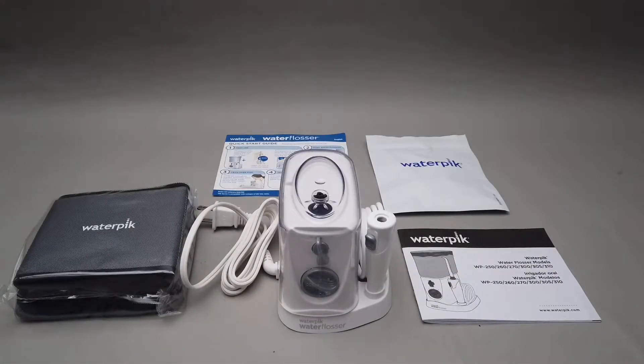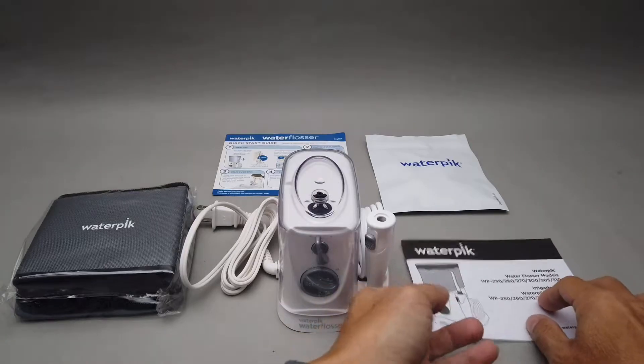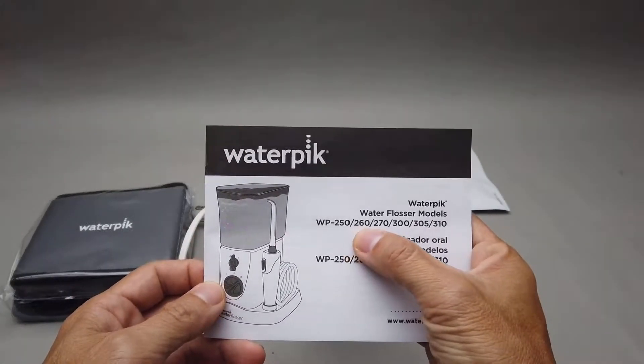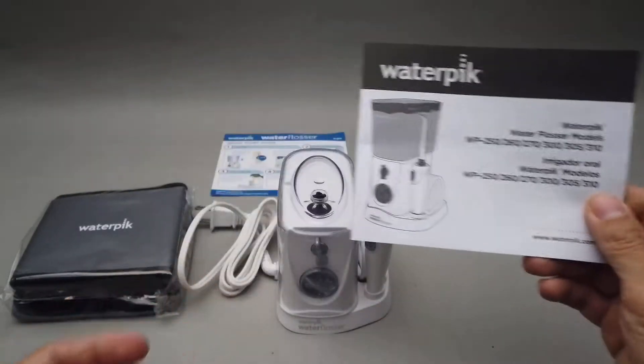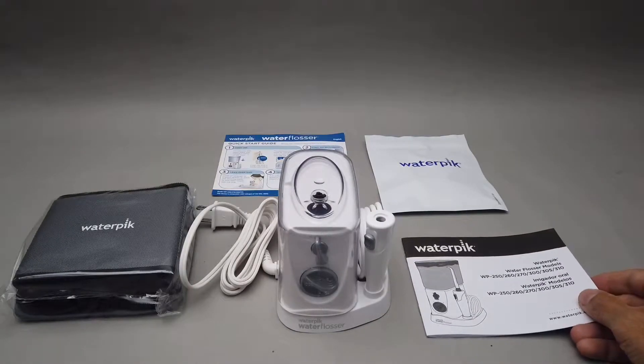Okay folks, this is the video of the Waterpik Nano setup, right after unboxing. The model here includes WP-250, 260, 270, 300, 305, and 310. I just quickly read through the instructions, so I'm just gonna show it to you really quick.